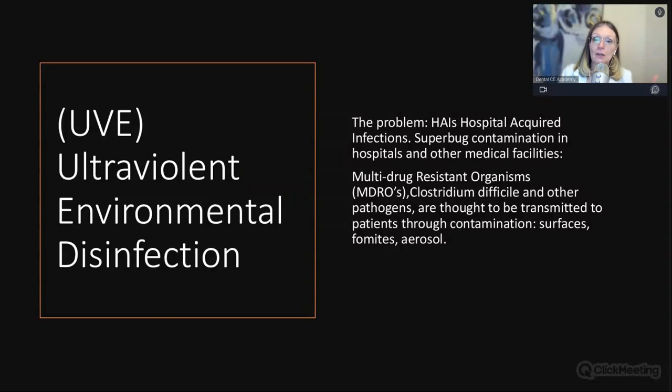When you have the very small particles that are generated, those can remain suspended in the operatories and anywhere in the practice for several hours. And they can be picked up by microcurrents, somebody walking by, etc.